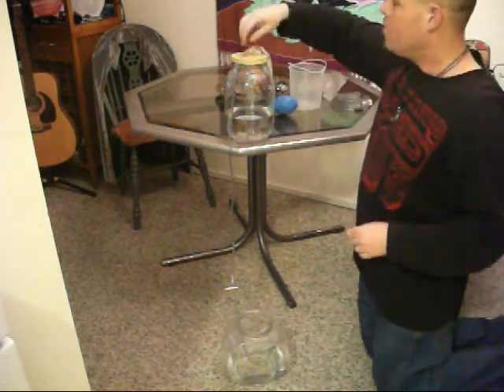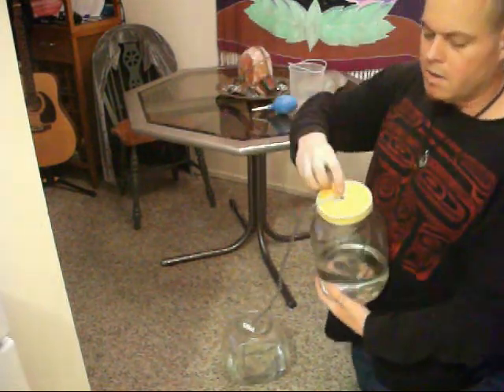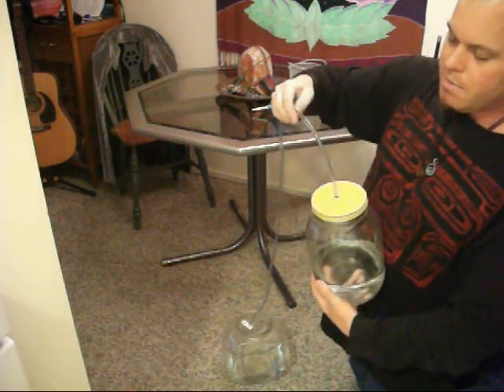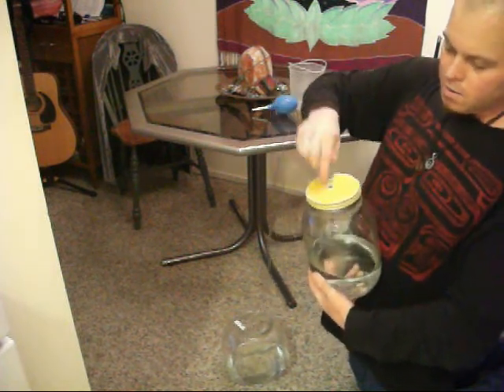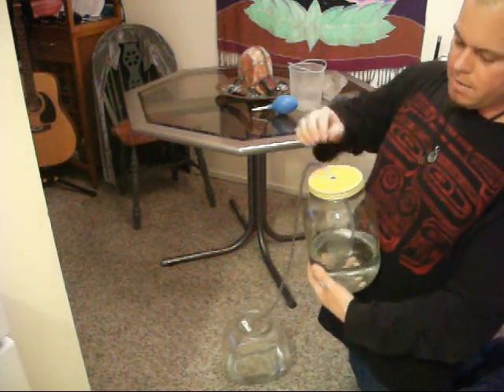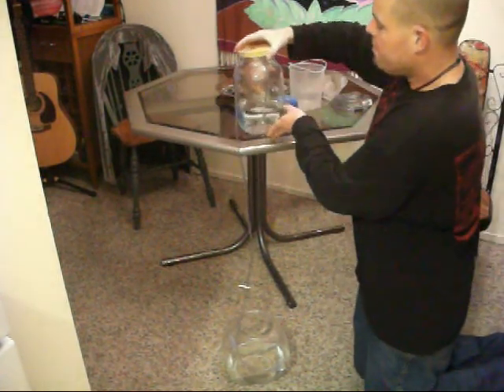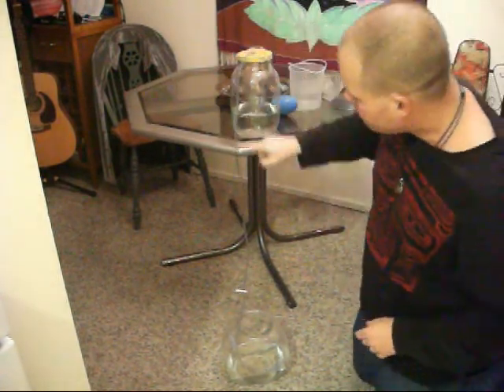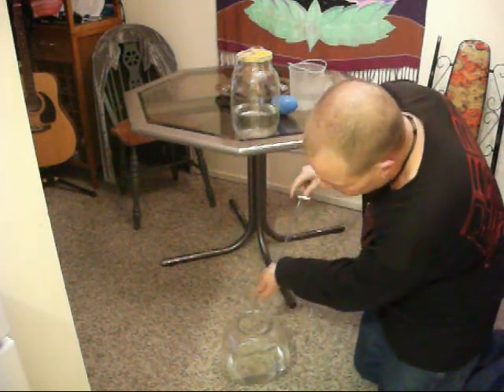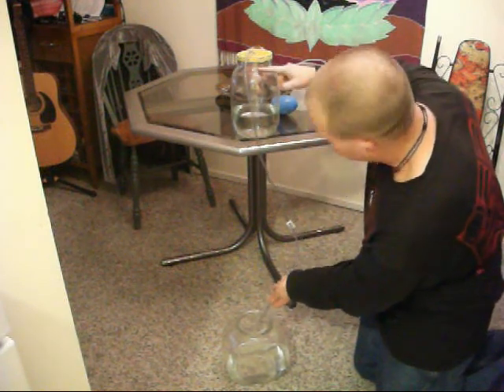So what I've done, one option here, is to actually drill a hole in the top of a lid of one of these, so when you stick the enema tube in, it goes all the way down to the bottom, or at least really close to the bottom. So it acts as a siphon. As long as you have the water down to here, look, if I turn this on right there, it's actually working, and that'll go all the way from the top jar.